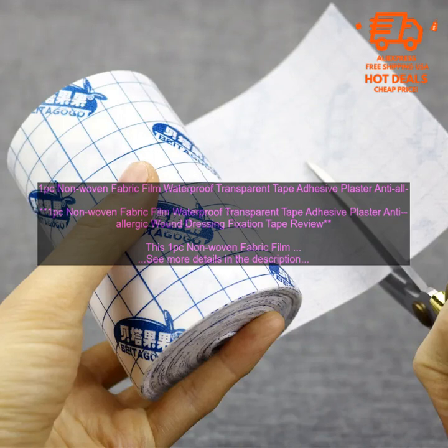Here are some common questions about this tape. Q: Is this tape waterproof? A: Yes, this tape is waterproof. Q: Is this tape hypoallergenic? A: Yes, this tape is hypoallergenic. Q: Is this tape breathable? A: Yes, this tape is breathable.